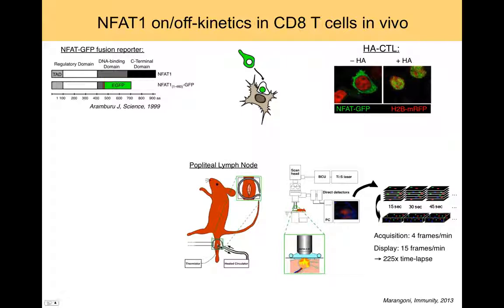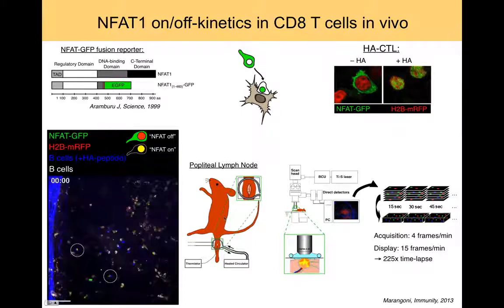And these anesthetized mice, as I said, we have visual access with our multiphoton microscope to this lymph node here with intact blood perfusion, innervation, and also afferent and efferent lymph flow of these lymph nodes intact. And we can again collect movies from these lymph nodes. And this is just an overview basically of such a lymph node here.